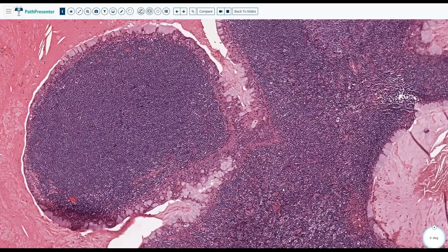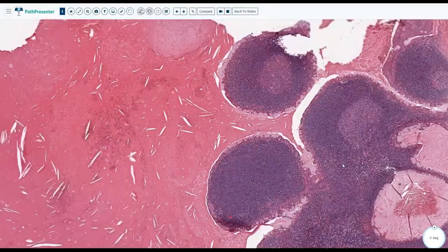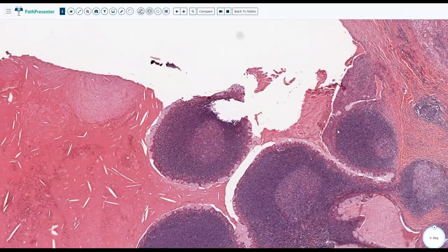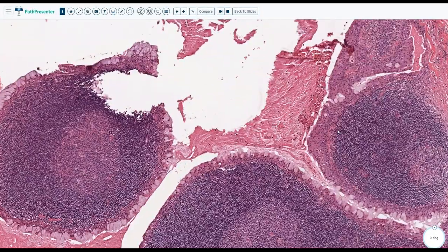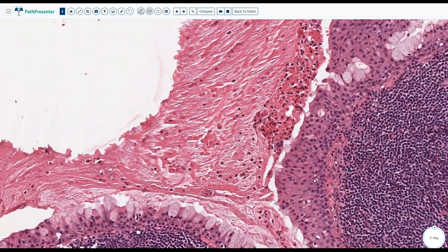Yes, oncocytic. All right. Do you know, guys, why there are oncocytic changes? Usually, what makes the cells pink? Excellent. So we'll see a lot of mitochondria. Usually mitochondria make the cells pink. All right. So what happened here?